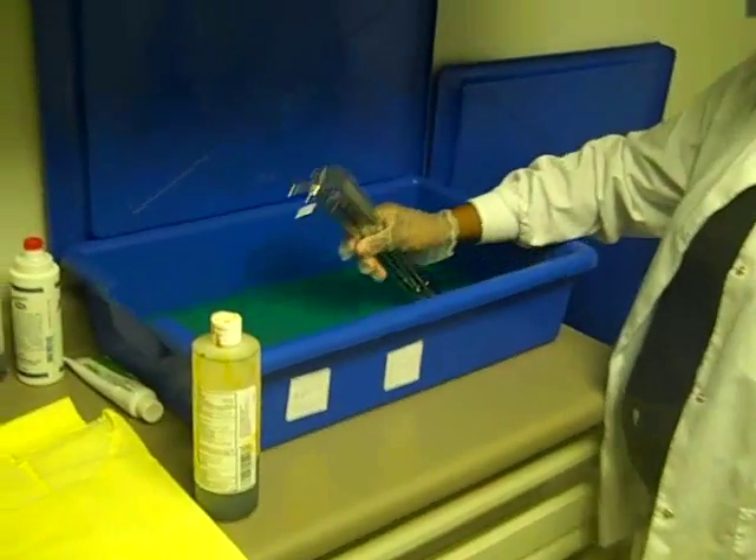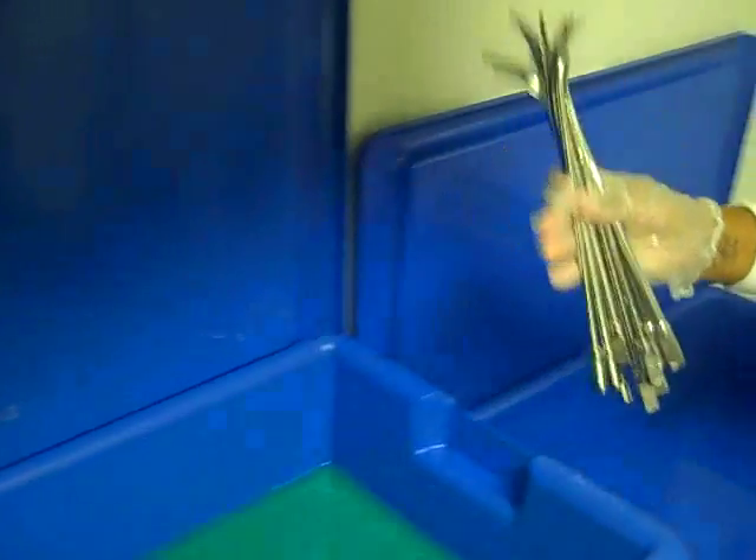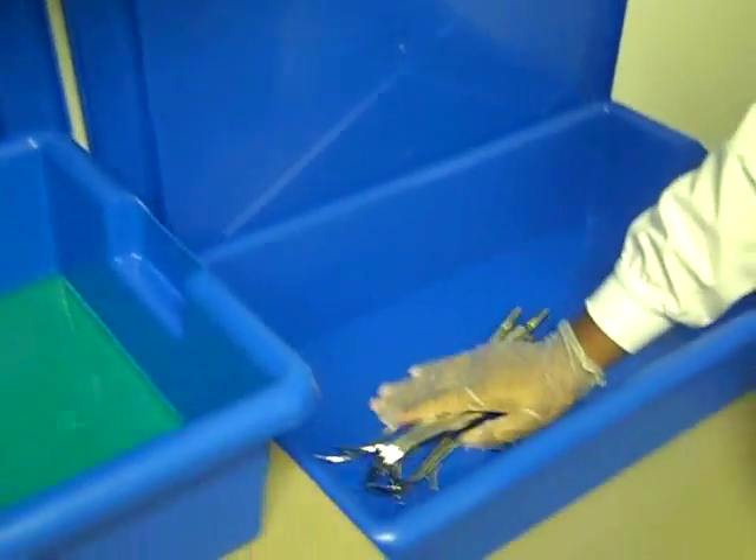Okay, we're setting up here for a urethral dilation. These are the urethral sounds, also called dilators. These are kept in this drawer, wrapped in a sterile pack.